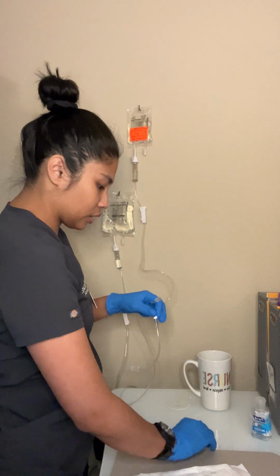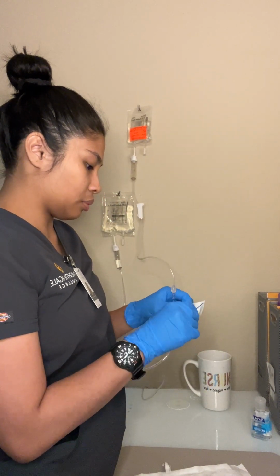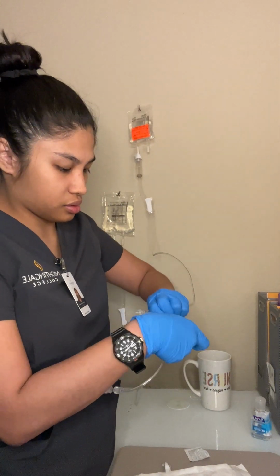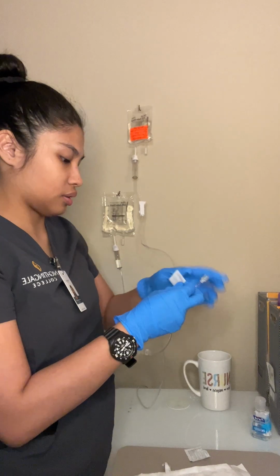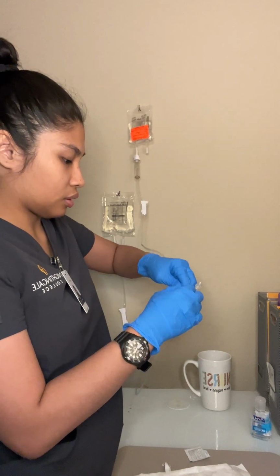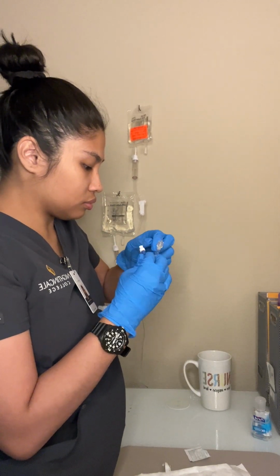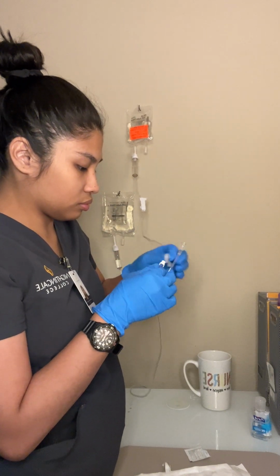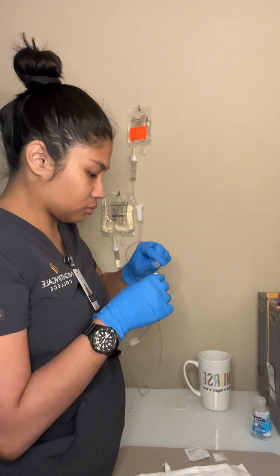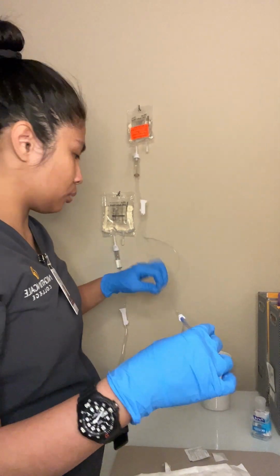With the use of an antiseptic swab, a little struggle. There you go.